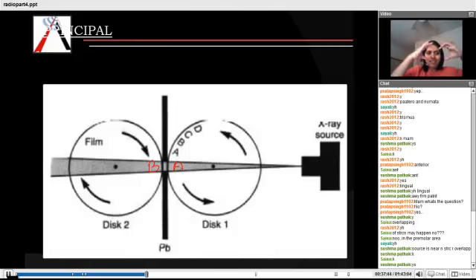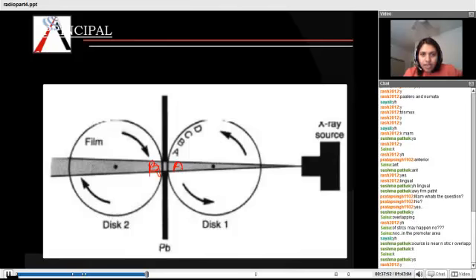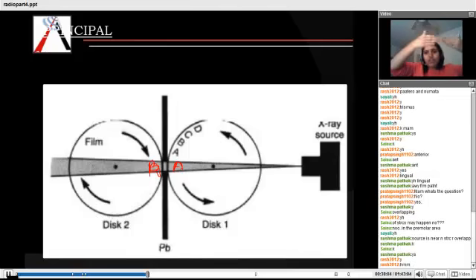When this comes like that, at that particular time, A comes here. This A is relatively stationary to this particular A. Are you getting the point? It's moving, but when the X-ray is passing through point A and the image is falling on this film, it becomes relatively stationary. At that particular time, they are not moving relative to each other.